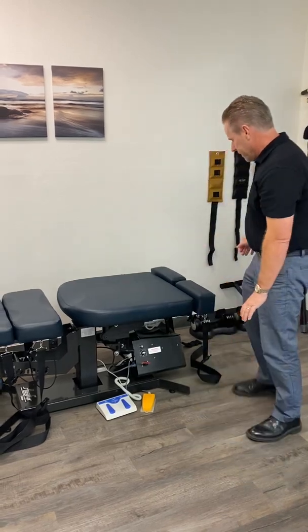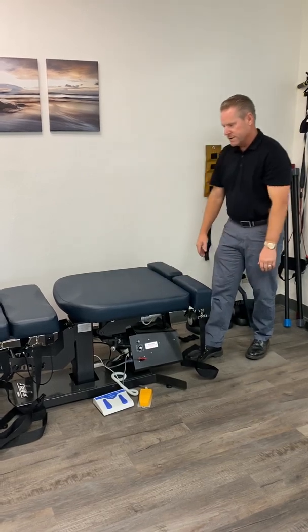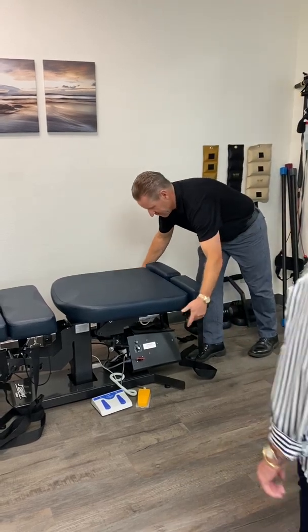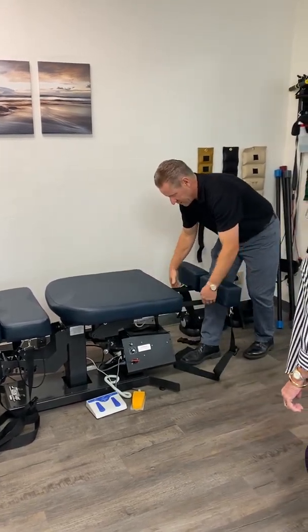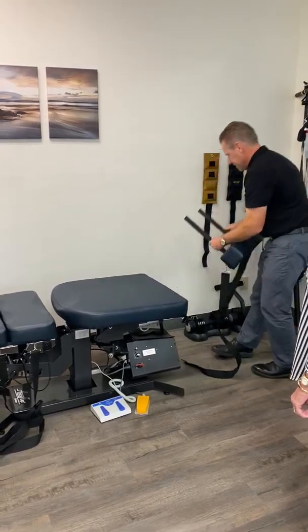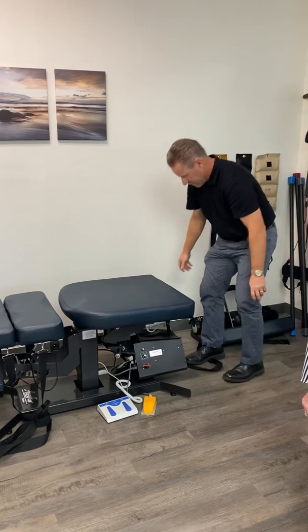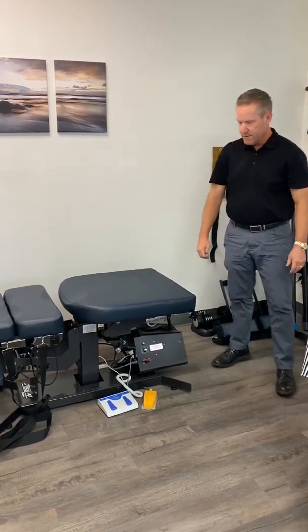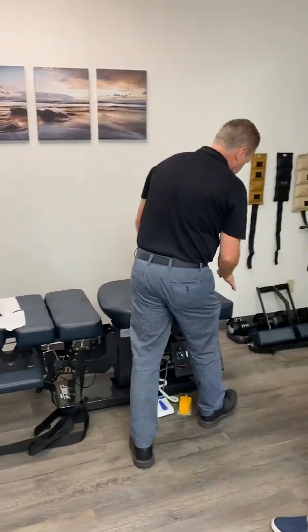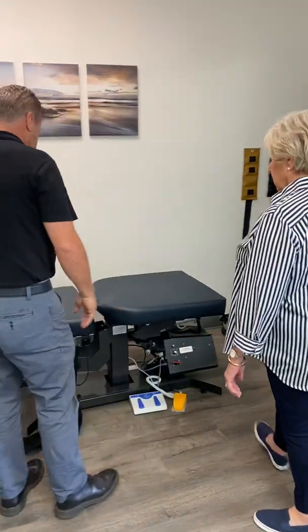So the important thing would be having the feet hang over the edge. So somebody that's closer to the 5-foot range here, we're gonna actually take this thing off, because again, we want feet hanging over the edge. Now, if they were really tall, we would have it extended out. And then of course, you'd need to tighten these things back up for a tall person, but we're not dealing with a tall person. So when you lay down on this, Mom, I want your ankles hanging over like this. So you're going to be on your stomach, and then we'll go from there.